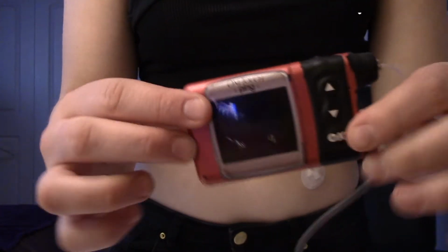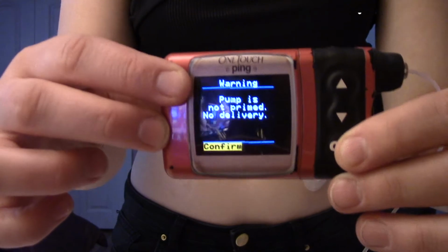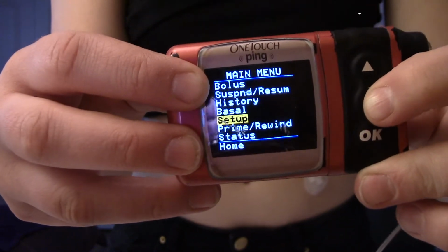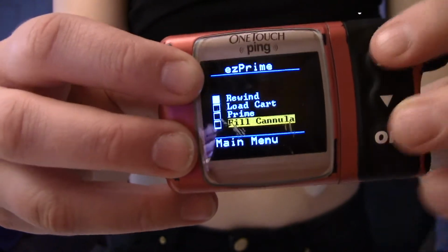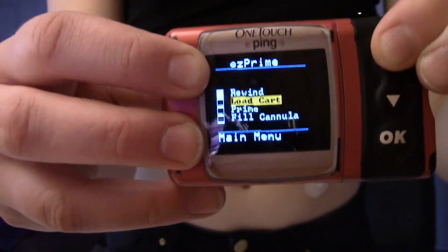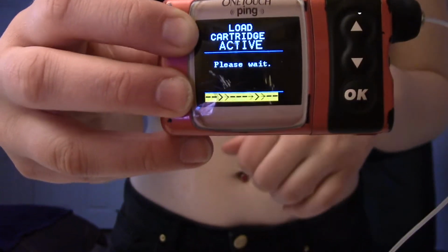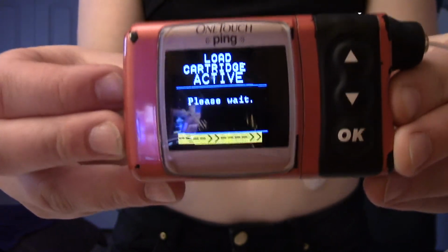So now I'm going to go to my menu. It's telling me it wants me to hook it back up. Going to go back to the primary menu. Going to go up to load cartridge. Press OK, and then press continue. This should take a little bit, depending on how much insulin you put into your cartridge.